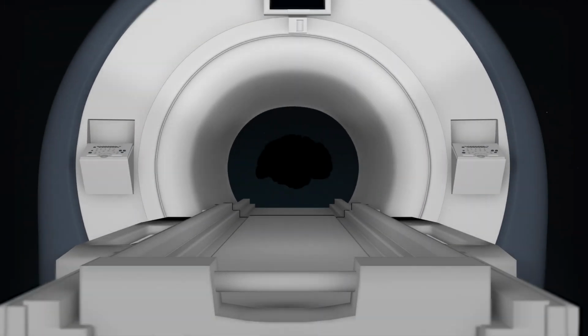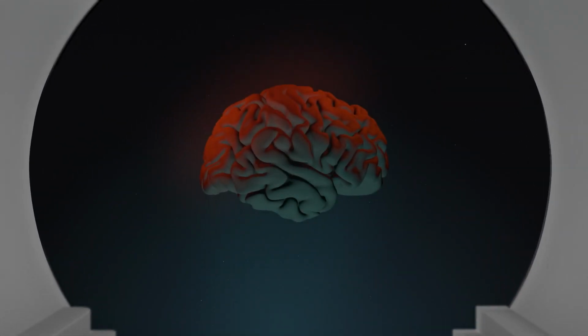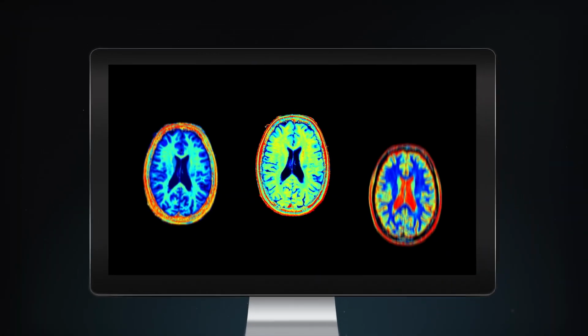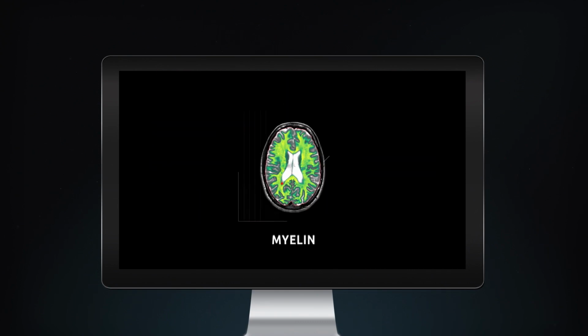I think it's really a very nice acquisition sequence and post-processing software, giving the ability to get 8 different kinds of contrasts back, and being able to change the TR, TE, TI values. Additionally, you get quantitative maps that have T1, T2, PD maps, gray matter, white matter, CSF, and myelin. So you get a huge value return for the amount of time that's spent to acquire the sequence.